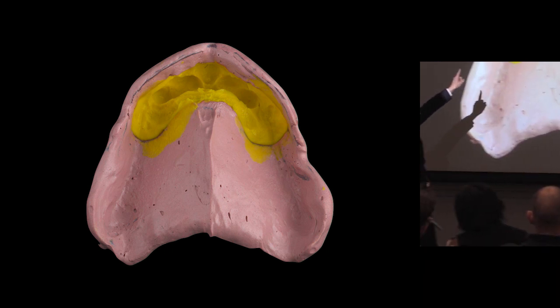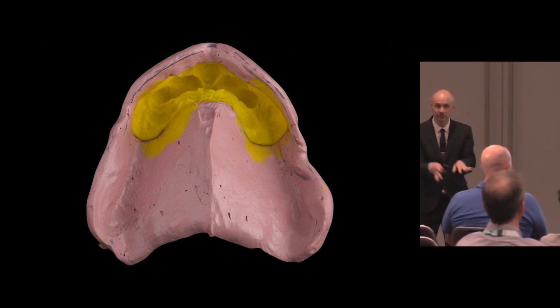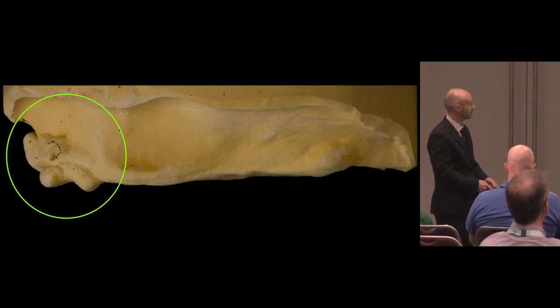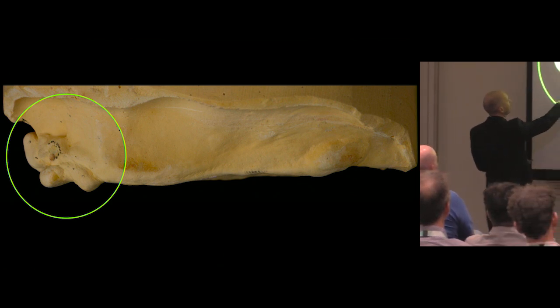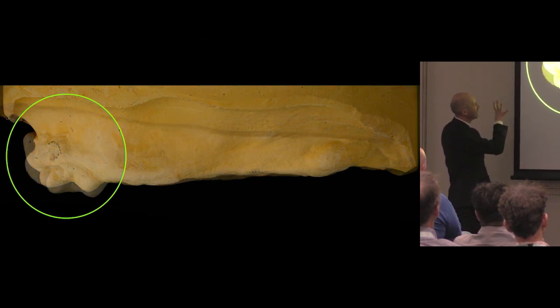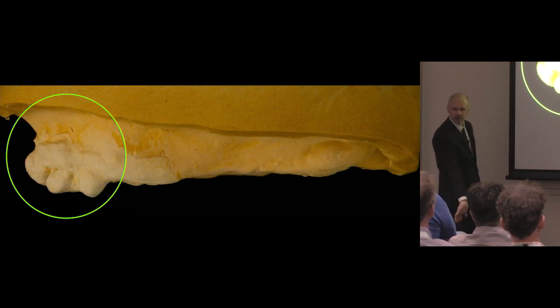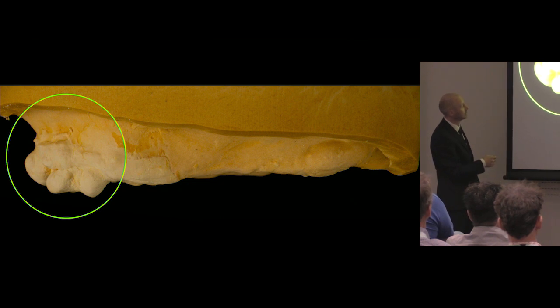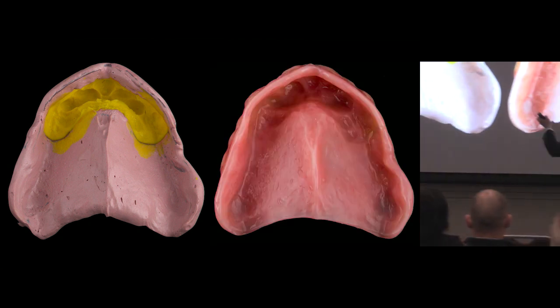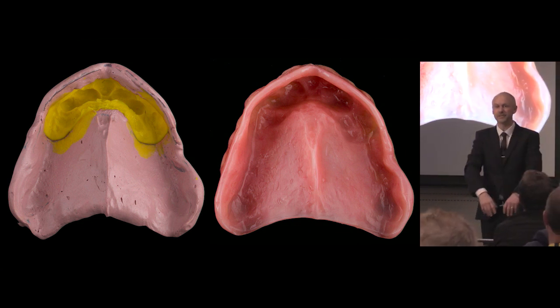And that's where the flabby ridge part just sits into that front bit there. So it's just been undisplaced like that. And if you look at my primary impression here, it's absolutely squidged that ridge. If I superimpose my definitive cast on that, look how it just relaxes. And then the denture's going to fit over that really nicely. And then Rowan really, really carefully copies it in the final denture there. So it's all nice, and that flabby ridge can just sit there.